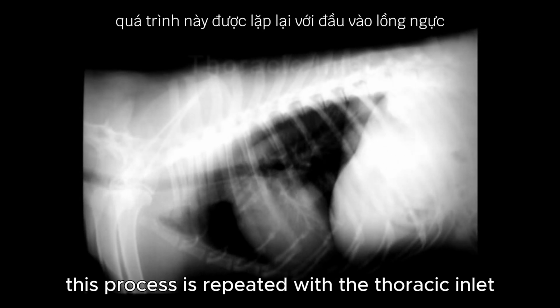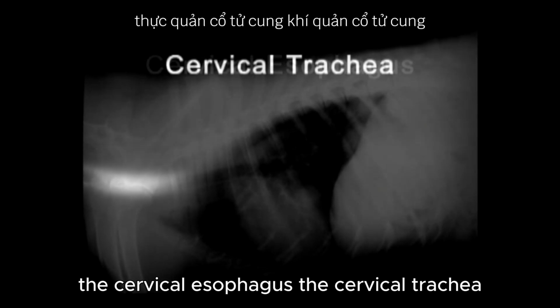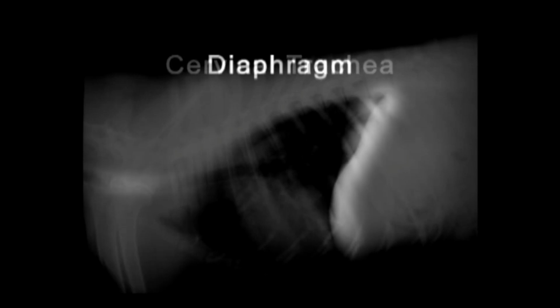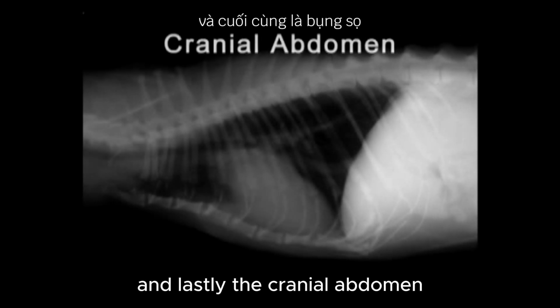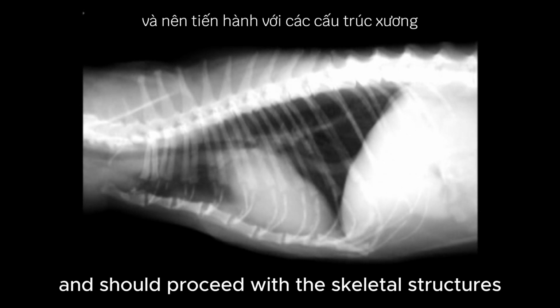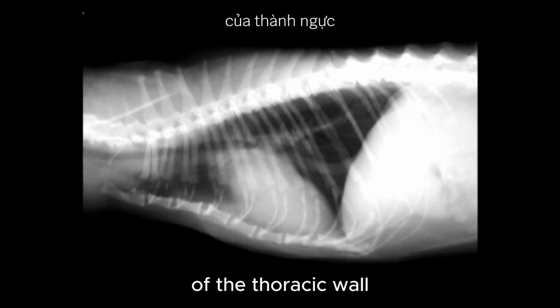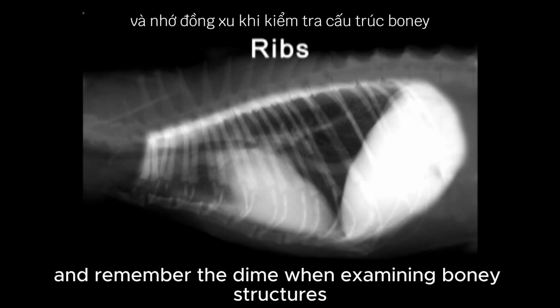This process is repeated with the thoracic inlet, the cervical esophagus, the cervical trachea, the diaphragm, and lastly, the cranial abdomen. Now you are done with the soft tissue examinations and should proceed with the skeletal structures of the thoracic wall. The ribs. You must force yourself to examine every rib and remember the dime.